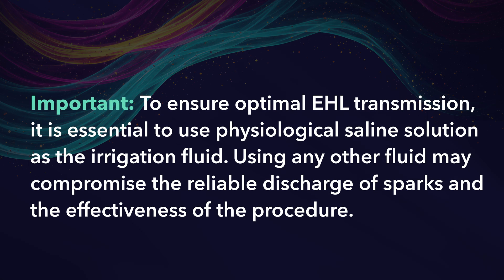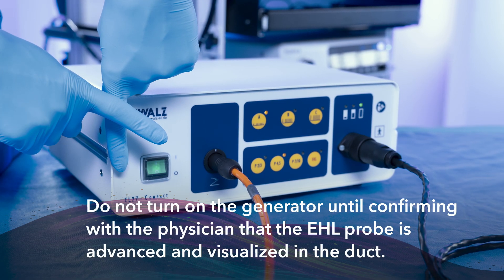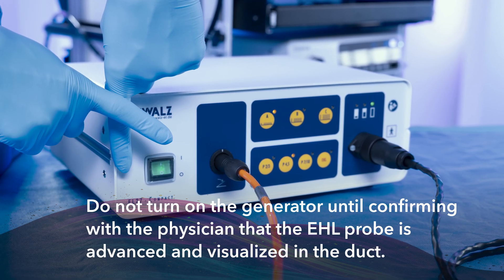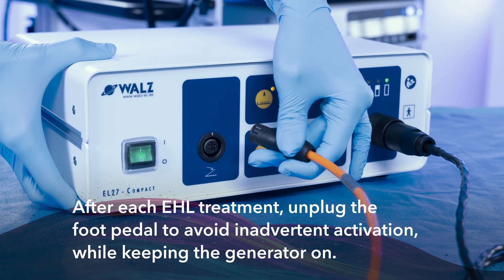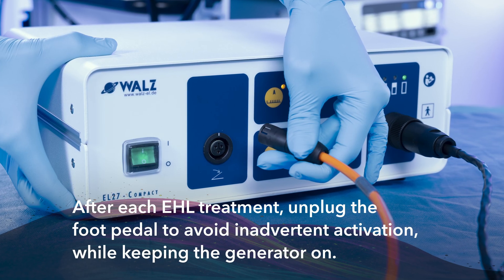Important. To ensure optimal EHL transmission, it is essential to use physiological saline solution as the irrigation fluid. Using any other fluid may compromise the reliable discharge of sparks and the effectiveness of the procedure. There is no standby feature on the generator. Do not turn on the generator until confirming with the physician that the EHL probe is advanced and visualized in the duct. EHL is initiated by powering on the generator. After each EHL treatment, unplug the foot pedal to avoid inadvertent activation while keeping the generator on.